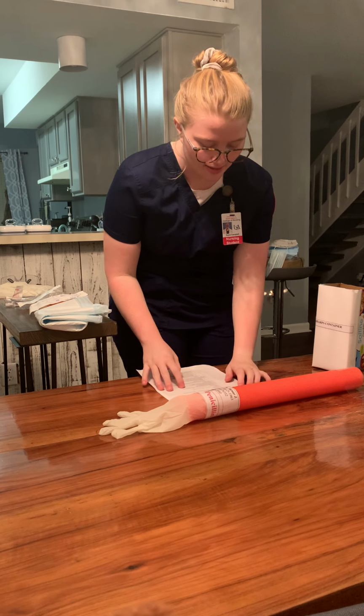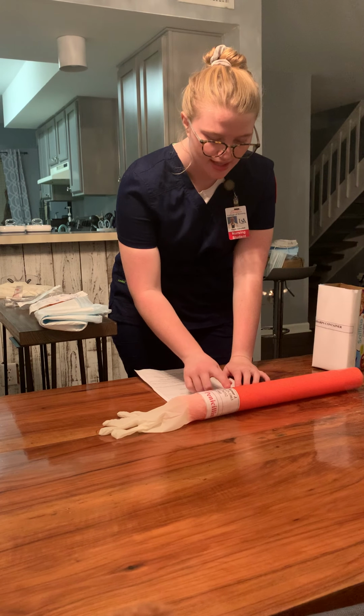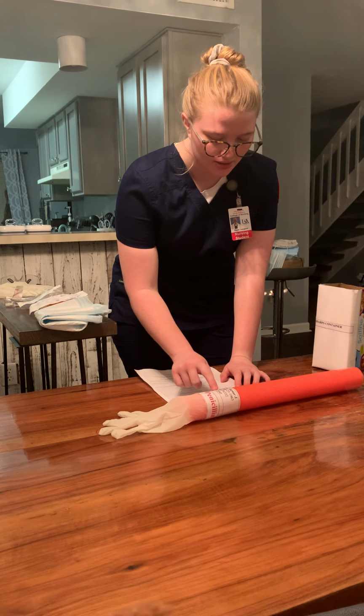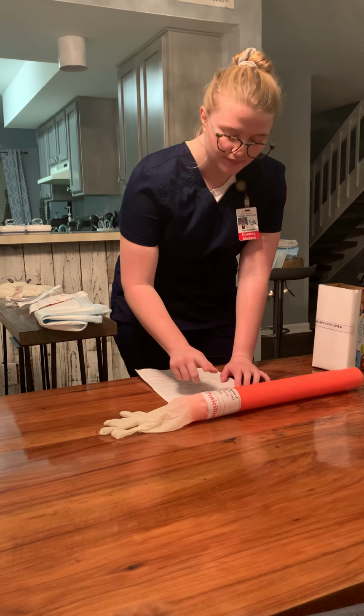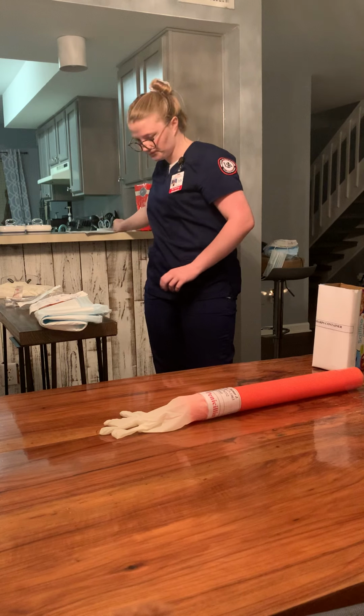And then I would identify the patient using two identifiers. So here we have Jaguar Jones, medical record number 4176352, and I do note an allergy to penicillin both here on the patient's chart and on his wristband. So I'm just going to set this aside now.